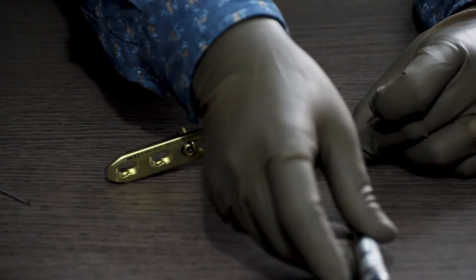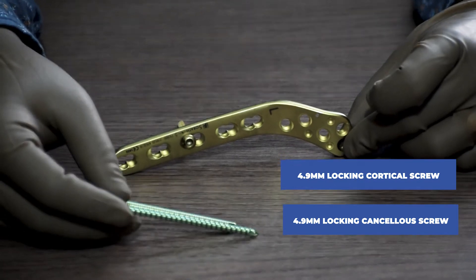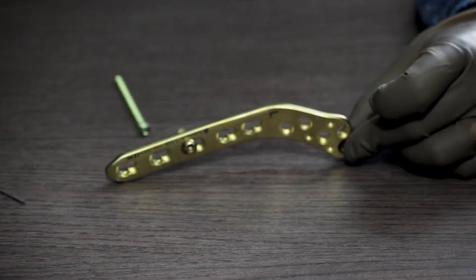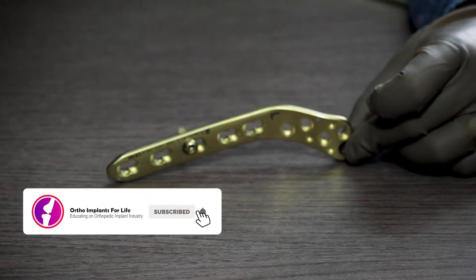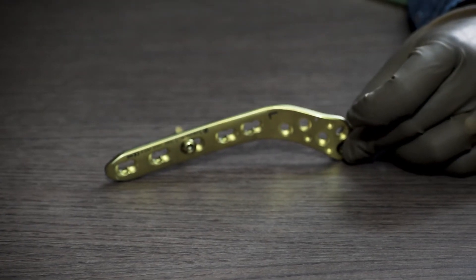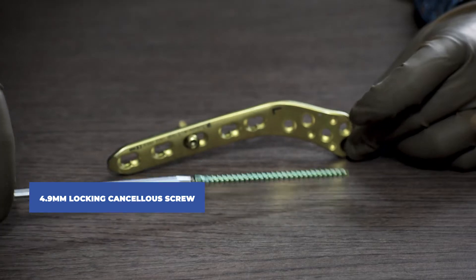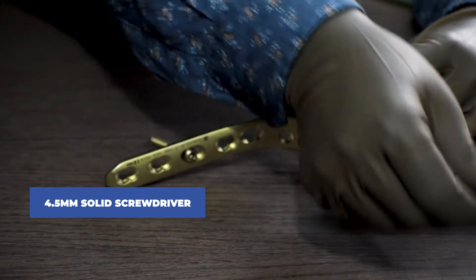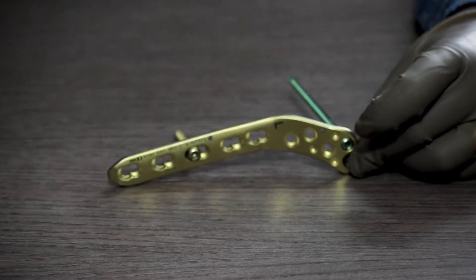There are two types of locking screws used to fix this plate: a 4.9mm locking cancellous screw and a 4.9mm locking cortical screw. Cancellous screws are used to fix the cancellous part of the bone. As the proximal part of the tibia is cancellous, we fix the proximal end of the plate with a locking cancellous screw. After taking the measurement, we take a 4.9mm locking cancellous screw of the measured length and, with a 4.5mm solid screwdriver, lock the screw with the plate on the bone.